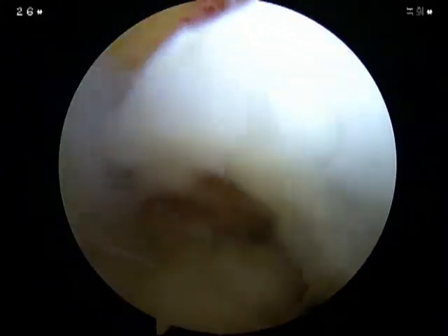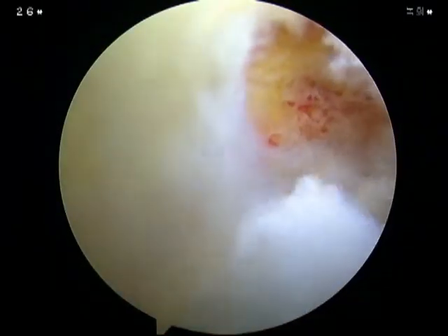After suturing, the capsule repair is confirmed through the arthroscope and adjacent tissues are cleared using arthrocare.